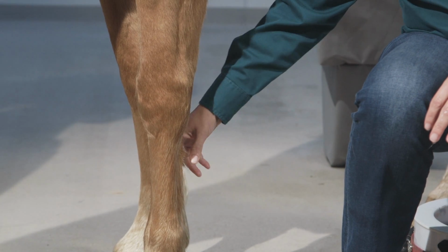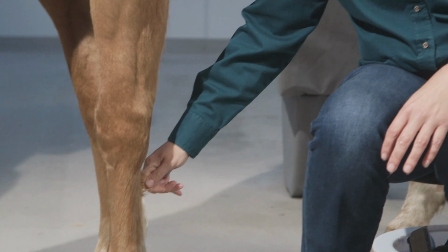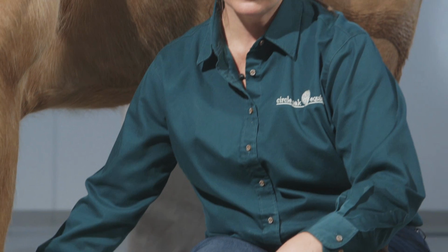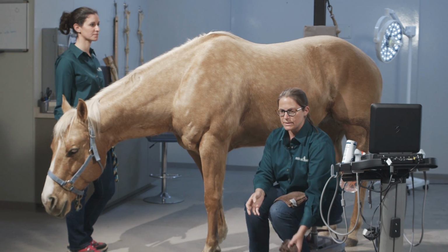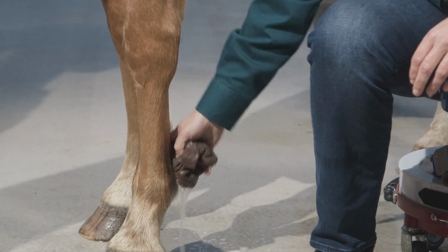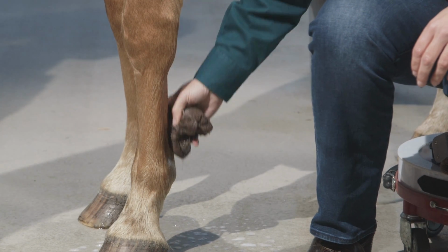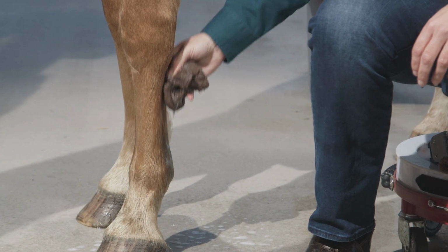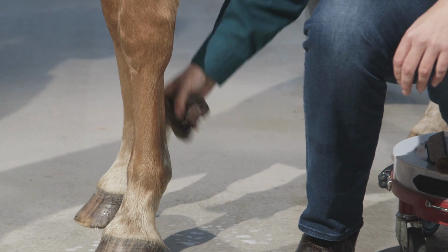So you can imagine that with all this hair, we also have a lot of debris that gets caught up underneath it. So we're going to give it a really good quality scrub in the area of the ultrasound. In fact, expanding beyond the area of the ultrasound that we're going to do. It's really important you don't use too much sudsy soap in scrubbing, especially with hair on, because the air bubbles will get caught underneath the hair, and that'll prevent your image from being a good quality image. So a lot of times at the end of the scrub, I'll wipe downward, wipe with the hair as I go.